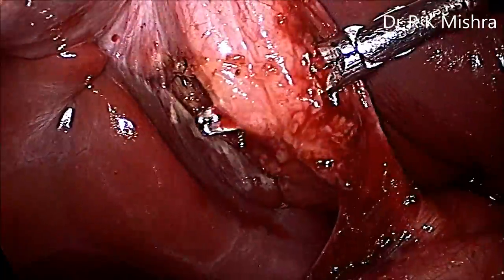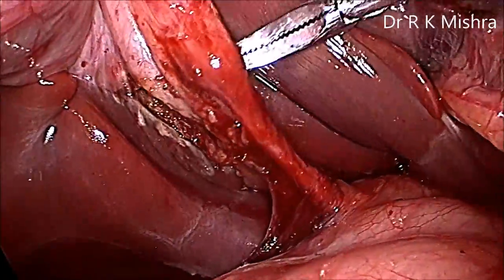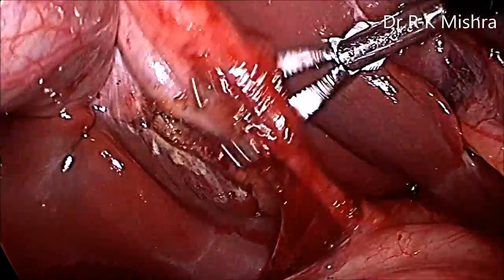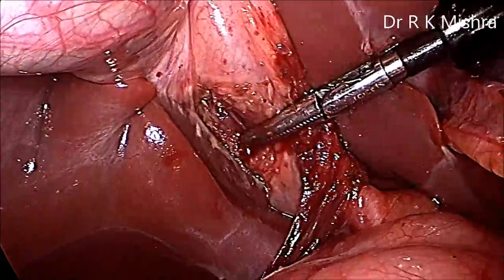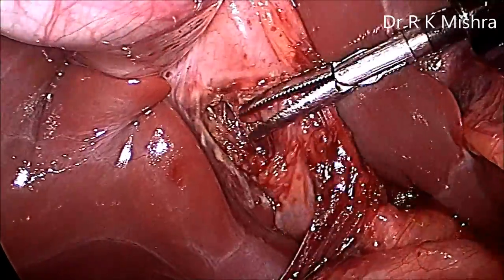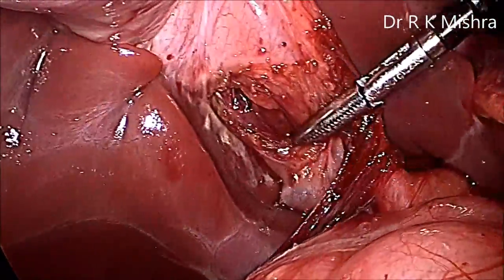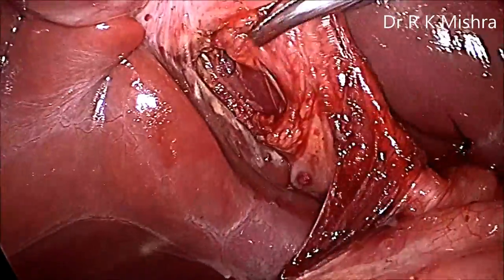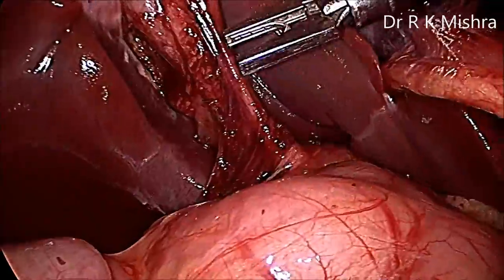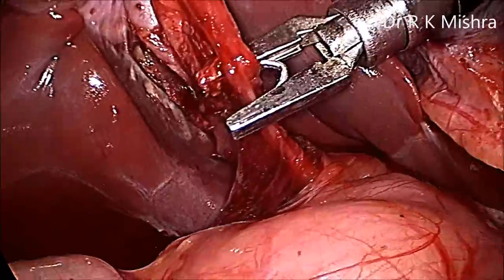This way you can make anterior and posterior windows in the Calot's triangle. As we know in laparoscopy, the inferior surface of the liver is very important to visualize, and both windows are now created. In this situation, the option is up to you — you can use a Hem-o-lok, clip, or a knot. Here for the cystic artery we are using a titanium clip; you can apply three clips.